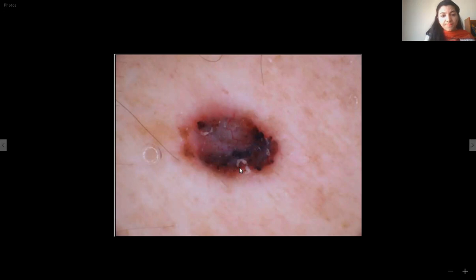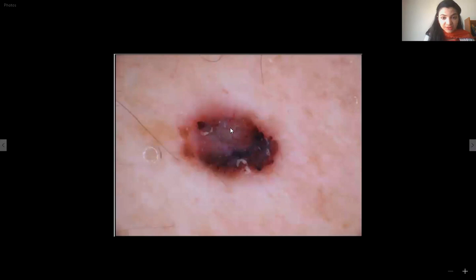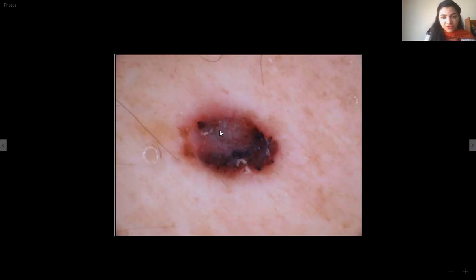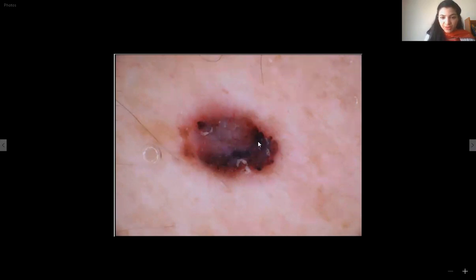How about this lesion? The lesion shows a little bit of ulceration, blue-gray dots and clods, and serpentine vessels running in the center that are very clear in focus. Some peripheral dots are also visible. A bluish-white veil is not characteristically seen; however, the central part shows a whitish color that may be due to fibrosis. Other than the serpentine vessels there is no other vascularity, and at certain places there are big clod-like structures. This one is a pigmented BCC.